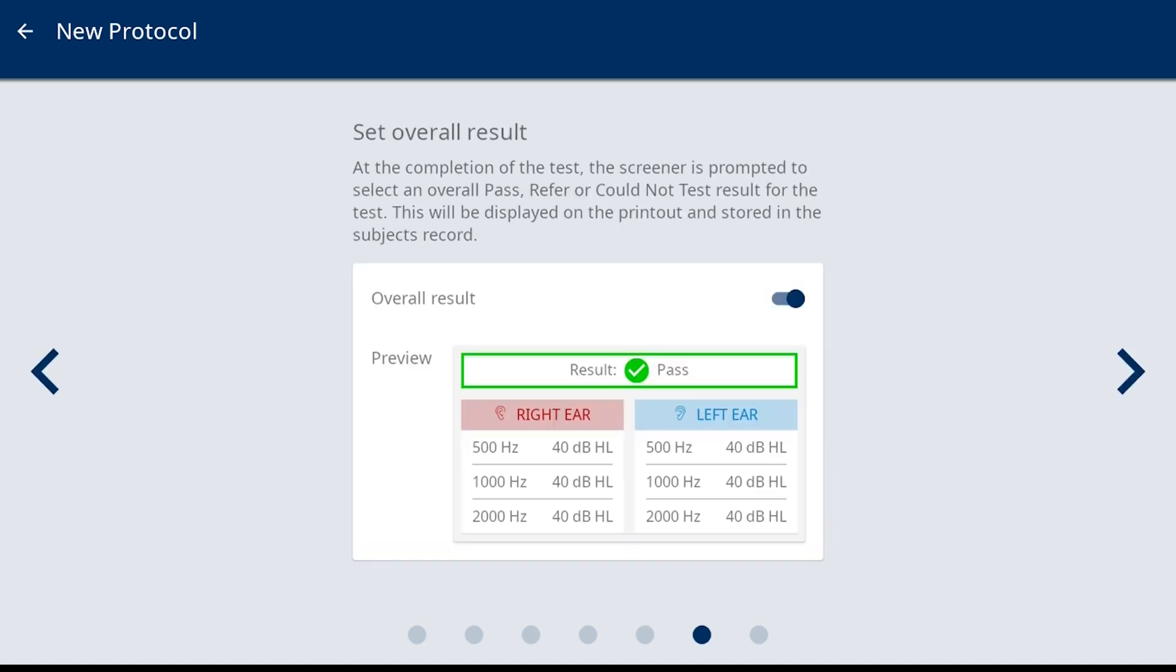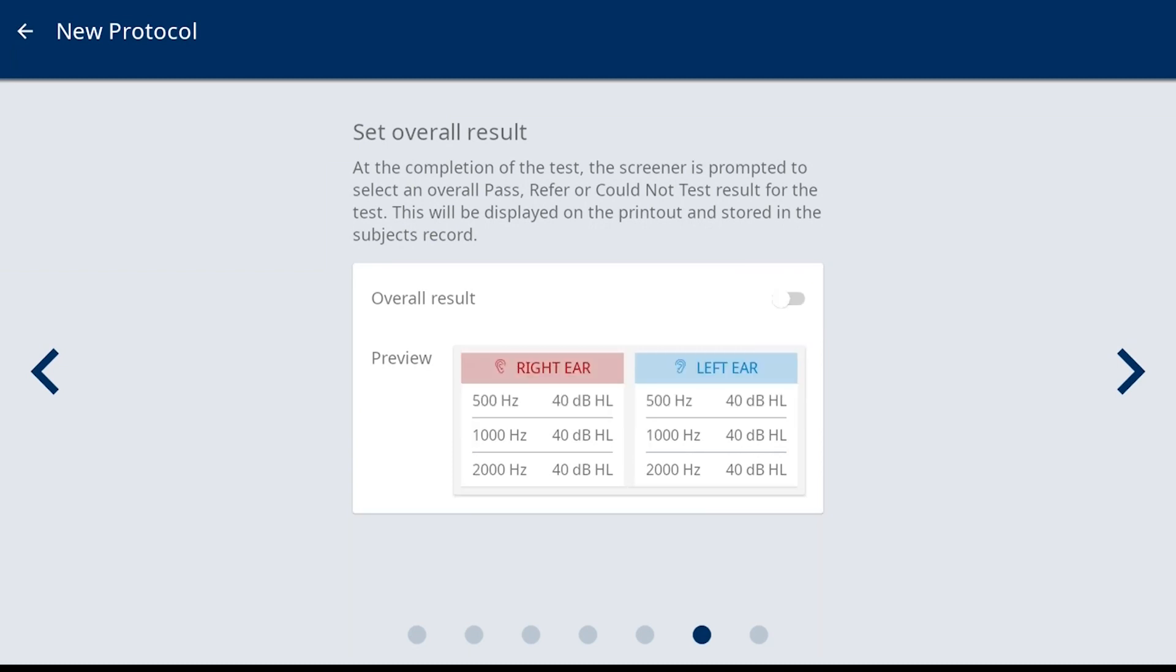Set Overall Result is the sixth selection screen. This will allow selecting and displaying an overall pass, refer, or could not test for the result documentation, along with the individual frequency results. This is defaulted to on and a preview of the report is shown. By selecting the slider, a preview of the report without an overall result is displayed.